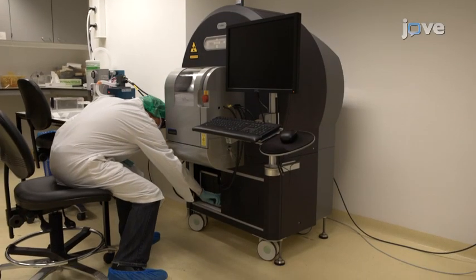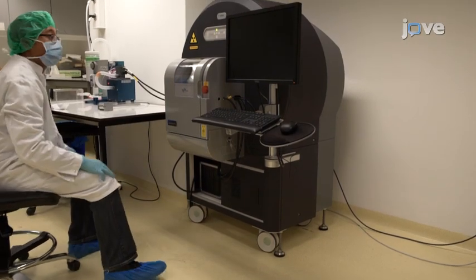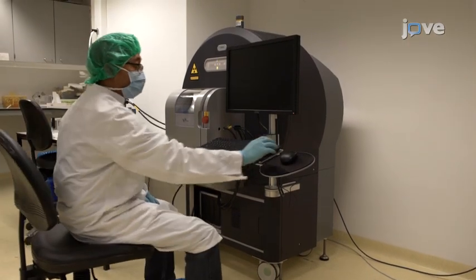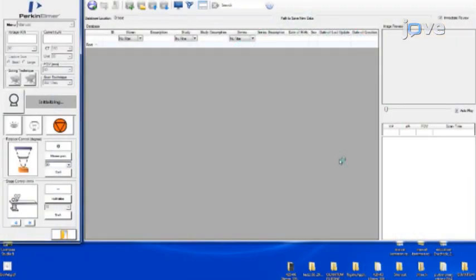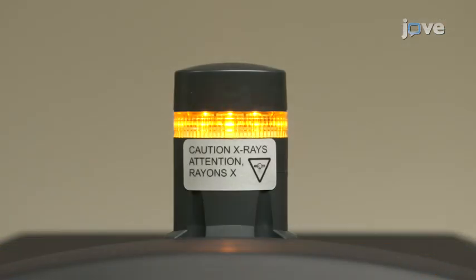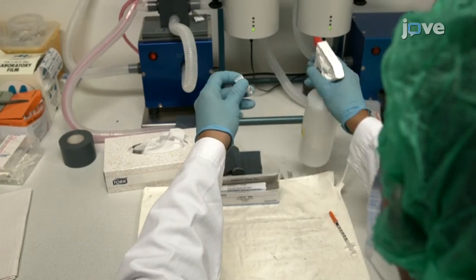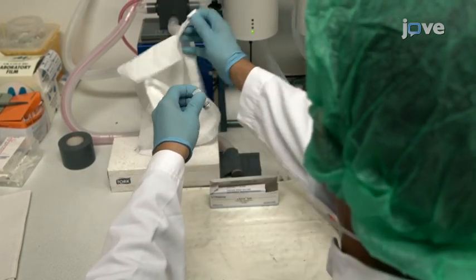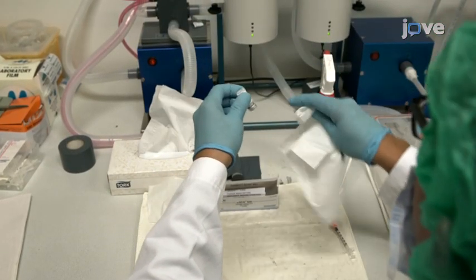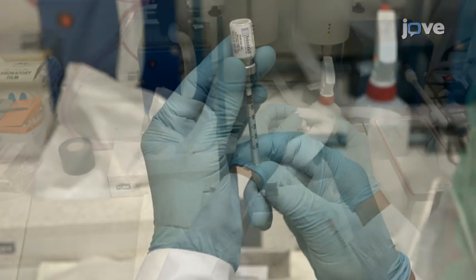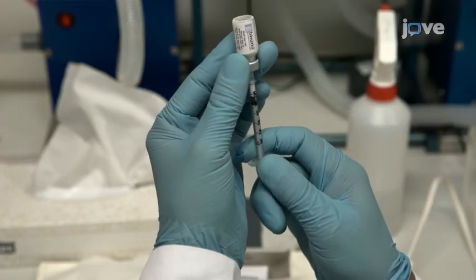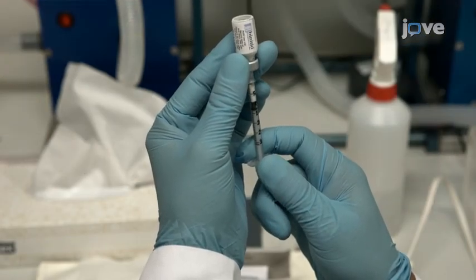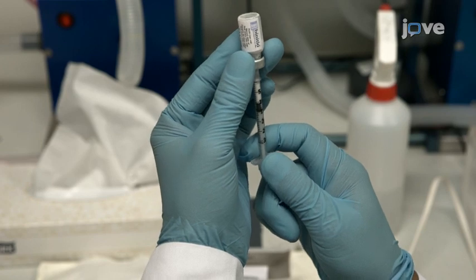Three to four hours after the surgery, turn on the micro CT scanner, open the micro CT control software, and warm up the x-ray tube. Then treat the rubber vial stopper of an iodinated contrast agent container with 70% alcohol, and use a low dead space syringe to withdraw 5–10 microliters of the agent per gram of the animal's body weight.